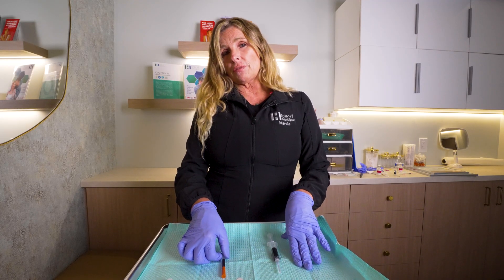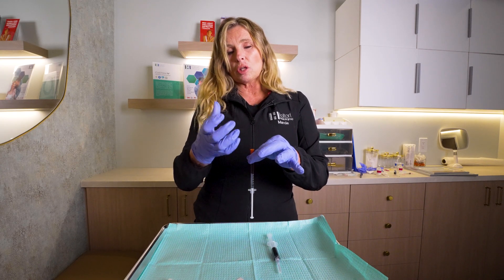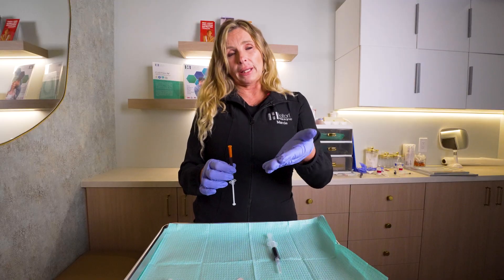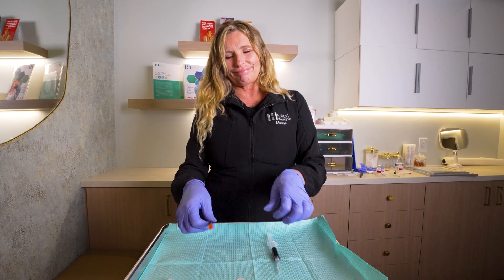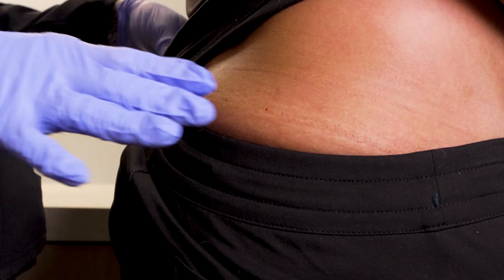If you've received your B12 as subcutaneous, then it comes already prepared to go. We'll go ahead and go over how to give yourself a sub-Q injection. We're going to do the B12 intramuscular first.